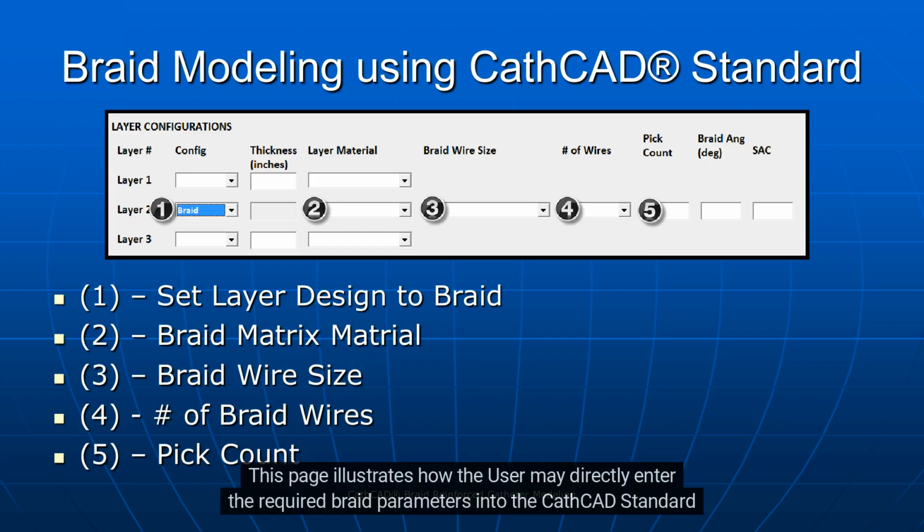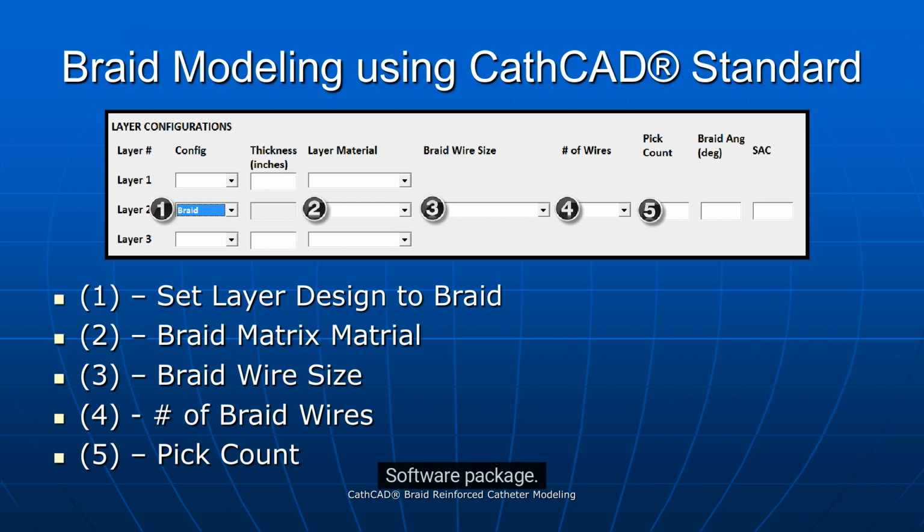This page illustrates how the user may directly enter the required braid parameters into the CathCAD standard software package. Step 1, set the layer design to braid. Step 2, select the braid matrix material. Step 3, select the braid wire size. Step 4, select the number of total braid wires. Step 5, enter the pick count.